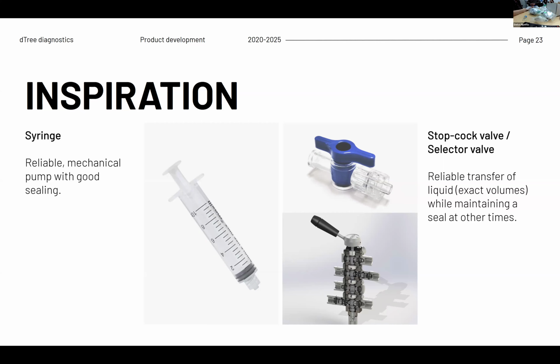And it is critical that you transfer an exact amount because the reagent stoichiometry is based on that. The reagents already stored in the device are meant to hold 25 microliters of sample and liquid, so when it's reacting, it needs that volume. So how can you transfer, when you're thinking about urine, someone would urinate like 100 mL, right? And you only need a subsample of that.